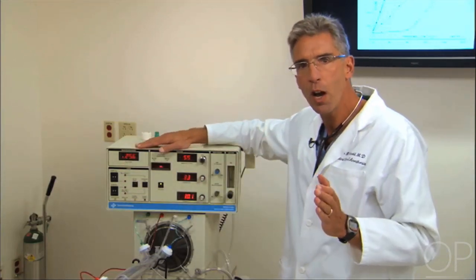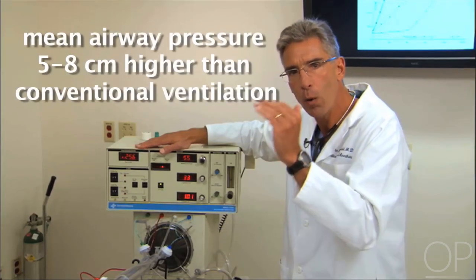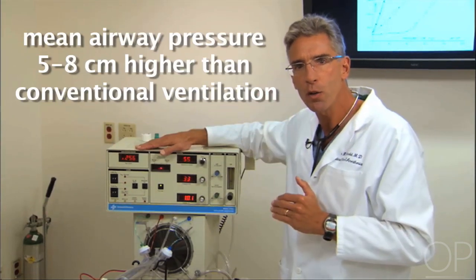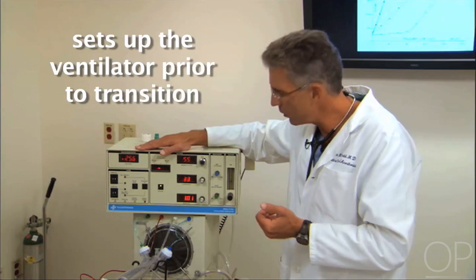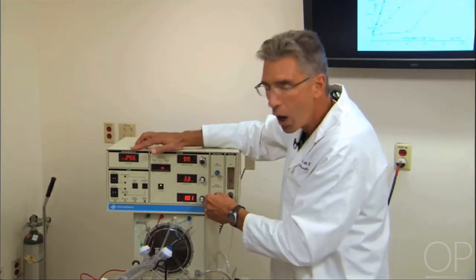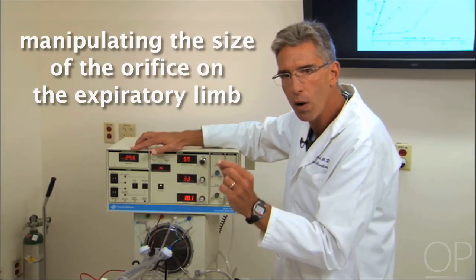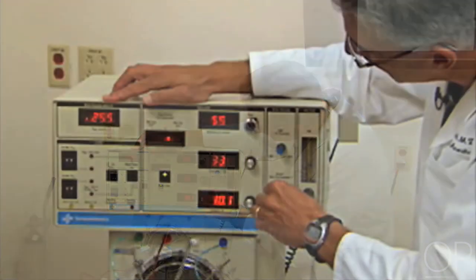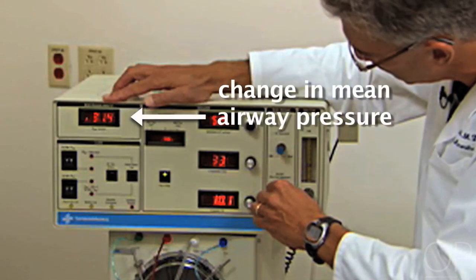As you know when we transition to high frequency, we will typically transition at a mean airway pressure 5 to 8 centimeters higher than we were on conventional. And one typically sets up the ventilator prior to transition. Now you can increase the mean airway pressure knob in one of two ways. You can adjust the mean airway pressure by manipulating the size of the orifice on the expiratory limb, which is what I do when I manipulate this knob. So I'm increasing mean airway pressure and I'm decreasing mean airway pressure.